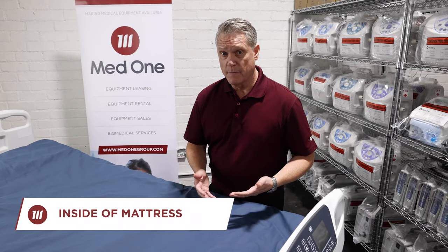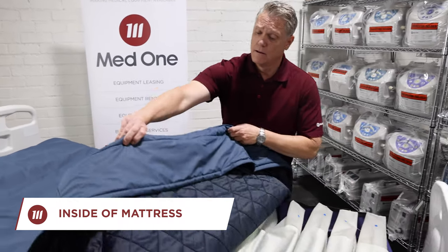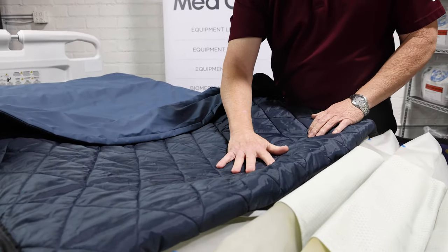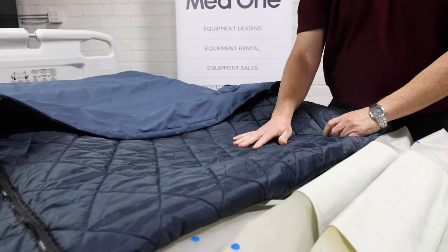And now let's take a look at the inside of the mattress. With the mattress deflated, I'm going to pull this cover back. The first thing you'll notice is this quilted design. This is done on purpose for patient comfort. As the patient lays on this, this is much more comfortable than laying directly on the air sacs themselves.